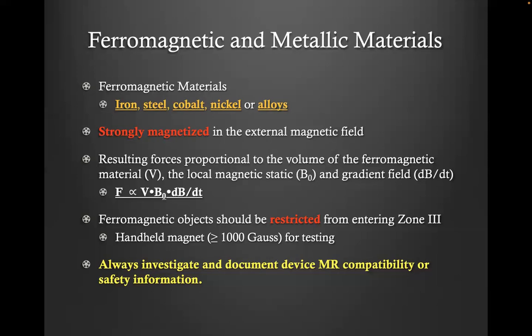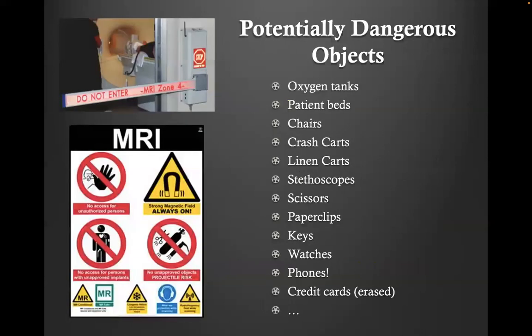And again, sometimes there are things, especially in patients' hair. There may be small beads in the hair, or there may even be hair gels that may be metallic. And they may even pass through your handheld magnet, but they may cause artifact in your image. So that's also something that you don't want. So again, something that you don't want to bring.